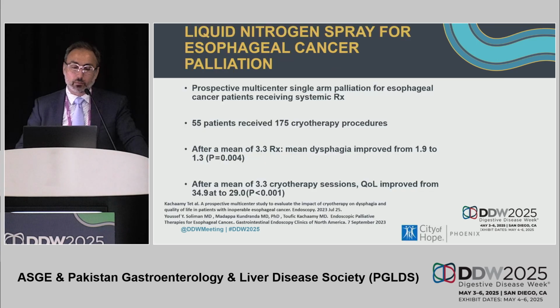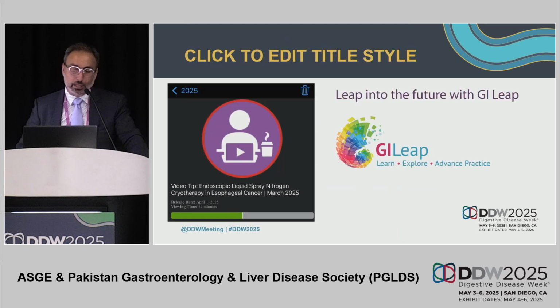Okay, so I was going to give 2 examples of luminal and US guided therapies. So liquid nitrogen spray cryotherapy for esophageal cancer, we did the research on it, has been shown, in addition to systemic therapy, to improve dysphagia and improve quality of life. And as part of the ASGE special interest group, we prepared a video on how to do it. It is available in GI Leap. I would encourage you to go and see the details of how it's done.